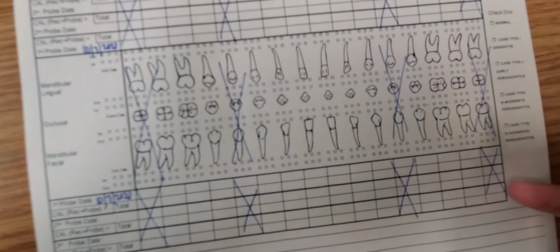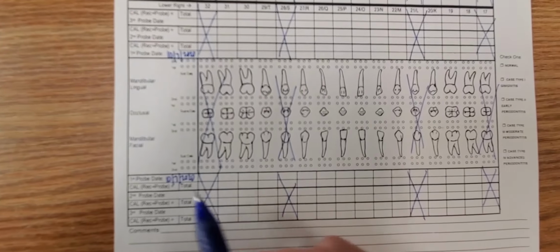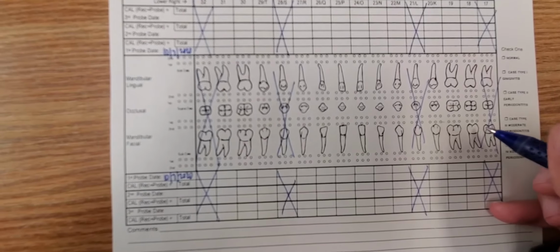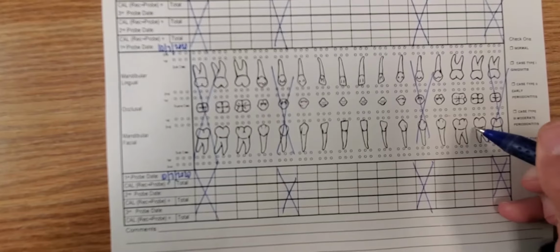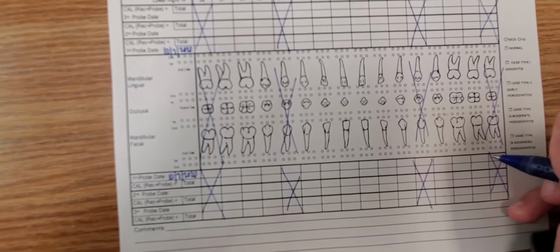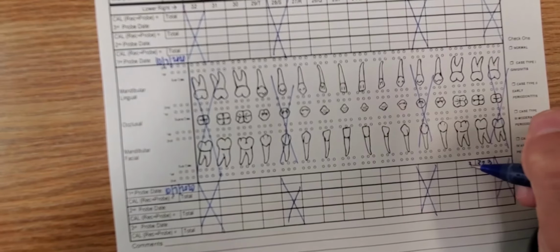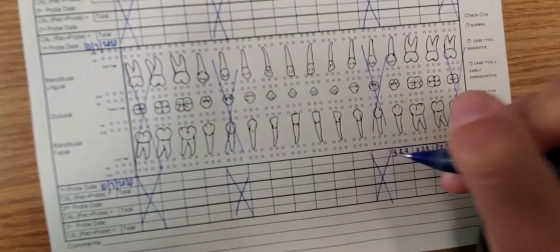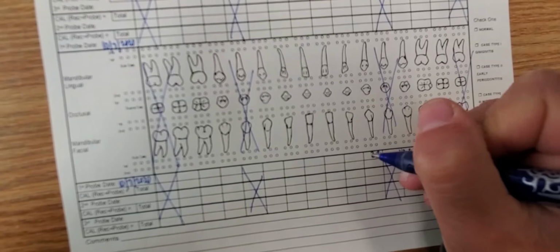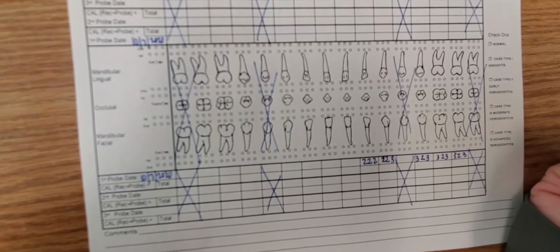When you get to the mandibular arch and you're ready to start in the sequence that we've identified, your numbers are going to go backwards. You're going to start probing at the distal line angle of the tooth, work distal, reinsert distal line angle, and work mesial. So your numbers are going to be called out 3, 2, 3, 3, 2, 3, 3, 2, 3, and you're going to write them backwards like that. 3, 2, 2, 2, 2, 2, whatever the numbers might be.